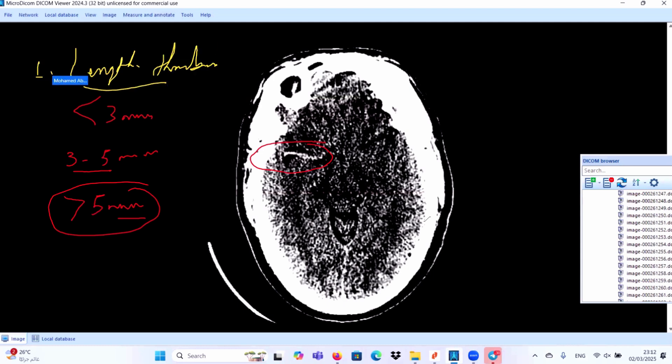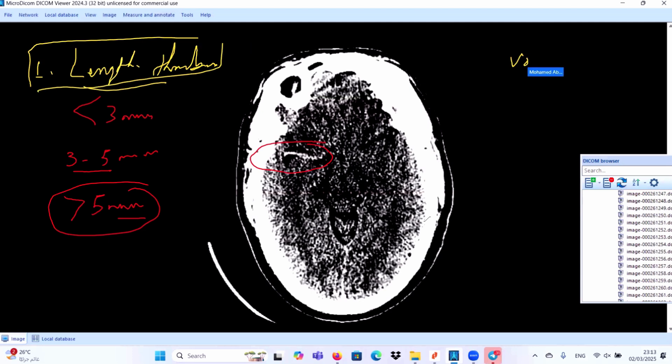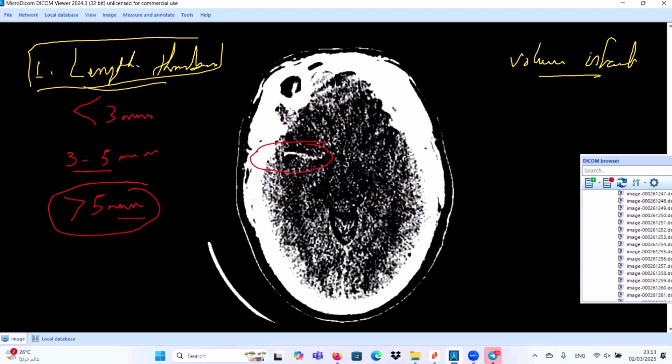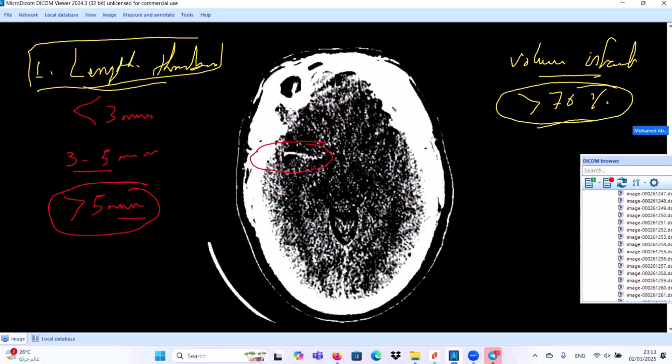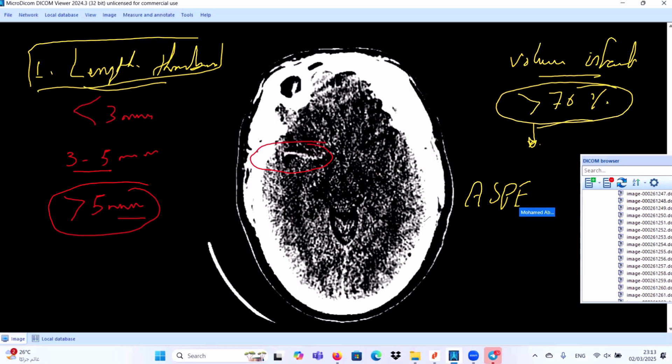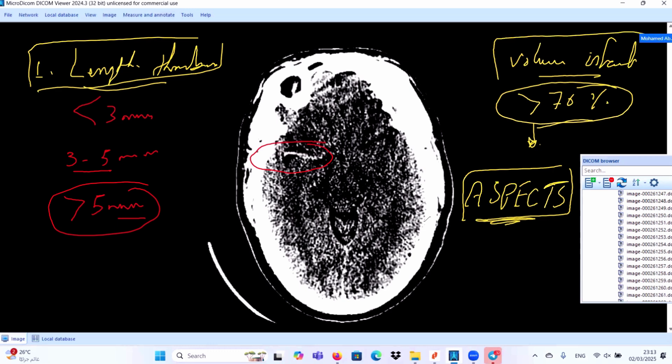The second secret point today is the volume of the infarction. If the volume of the infarction, for example right middle cerebral artery, is exceeding more than 70 percent of the territory, it is also a bad prognostic value. This can be measured by using ASPECTS score. We will discuss this point later in our videos: how to measure and calculate ASPECTS score. These two points are very important. I know it's not mandatory to write in your report, but if you try to write it, it will be more beneficial and more professional.